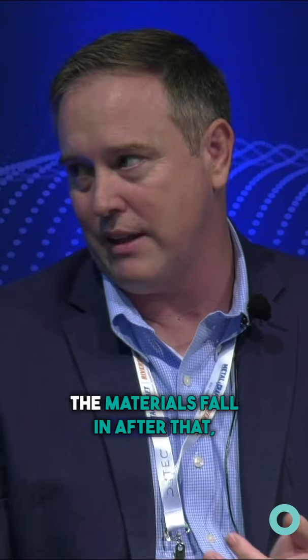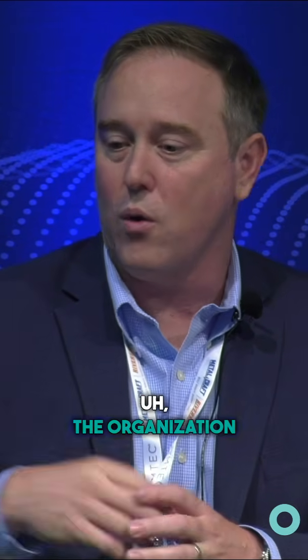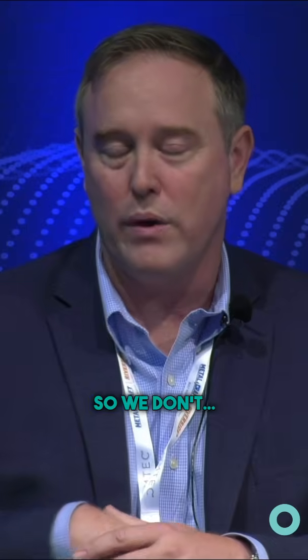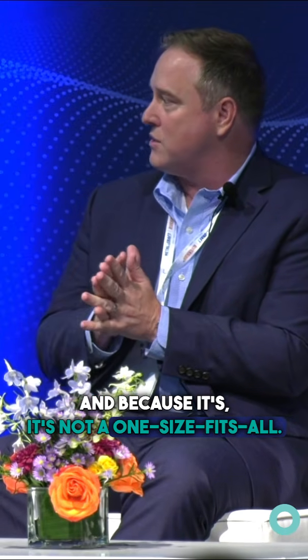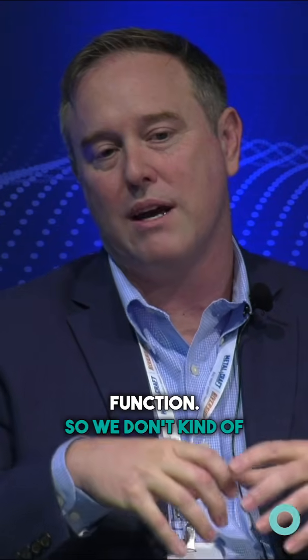The materials fall in after that, the design cues, whether it's a porous structure, the organization of those pores, right? So, you said something great yesterday, we don't like to just see the same 3 lattice structures, right? And because it's not a one size fits all. Yep. Lattice structure has to follow the intended use, the intended function. So we don't hold ourselves to any rigid idea of what a device should be until we understand the actual why of why you need something bioabsorbent.